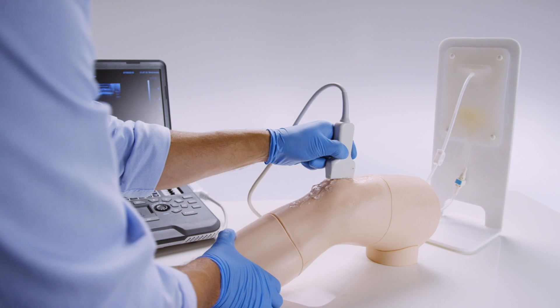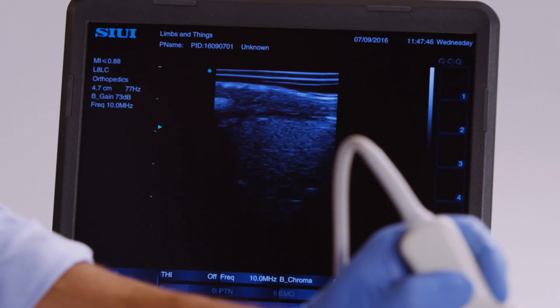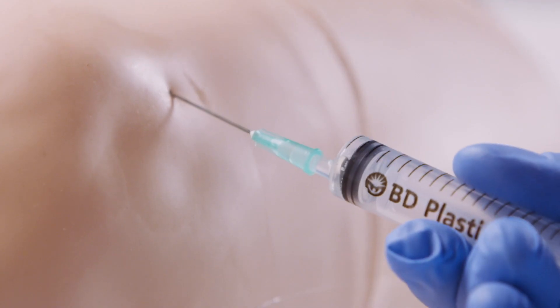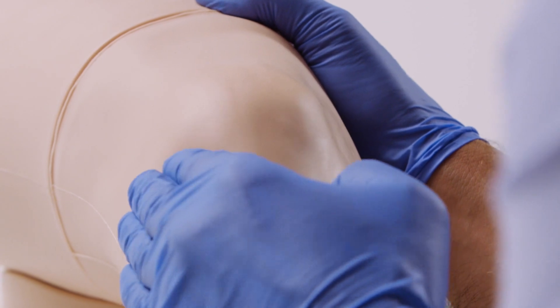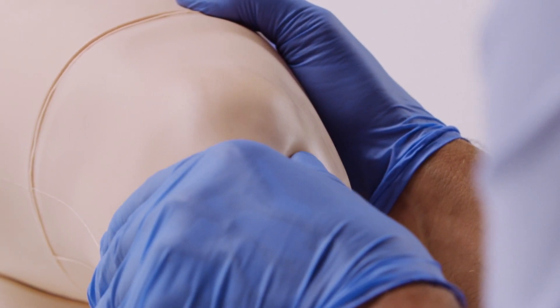The proprietary echolucent material allows the knee to be used with all standard ultrasound machines. Aspiration can be performed from both the lateral and medial aspects. The synovial fluid removed has a realistic color and consistency. The model has synthetic skin, muscle, and fat layers for a realistic tissue response when performing an injection.